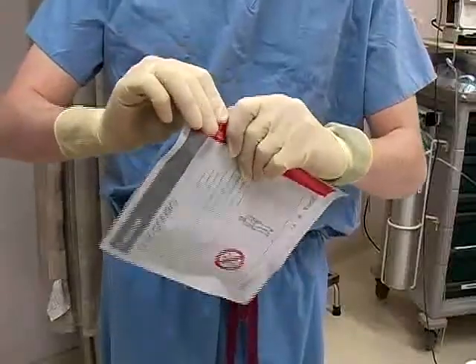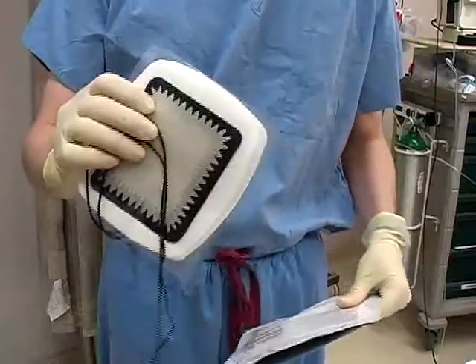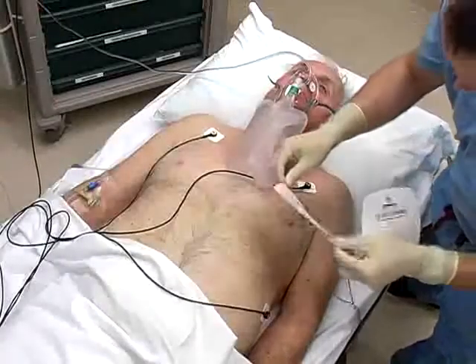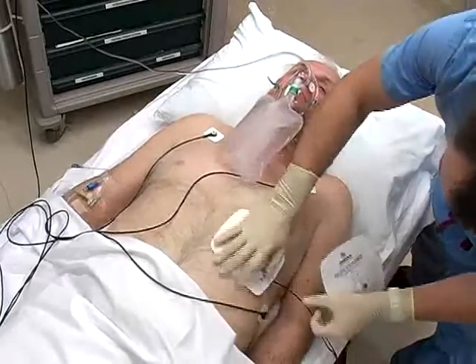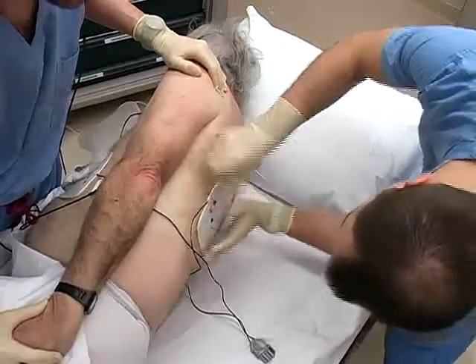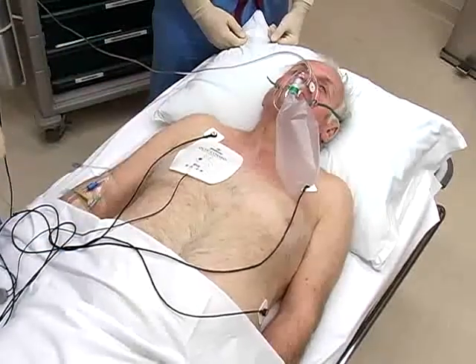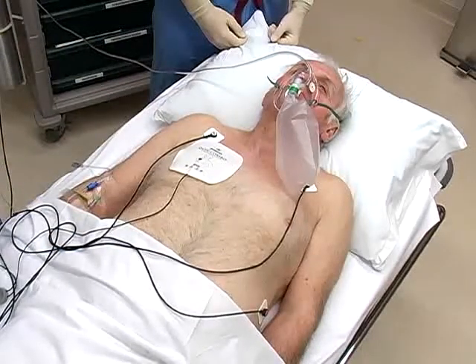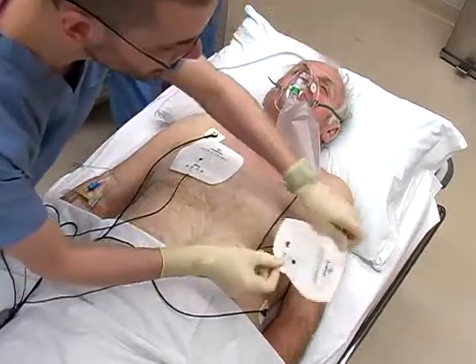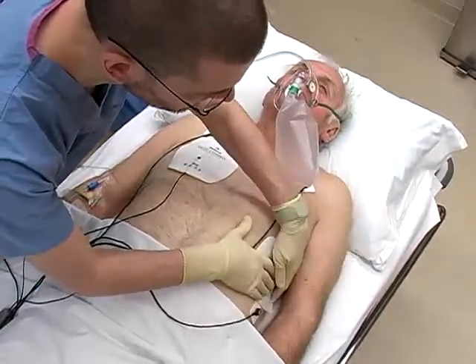Next, apply the defibrillation pads in the anterior-posterior position if possible. Place the anterior pad to the left of the sternum below the left breast and the posterior pad on the back, just below the inferior pole of the left scapula. Anterior lateral positioning may be alternatively used. Place the anterior pad to the right of the sternal margin at the second or third intercostal space, and the lateral pad in the left mid-axillary line at the fourth or fifth intercostal space.